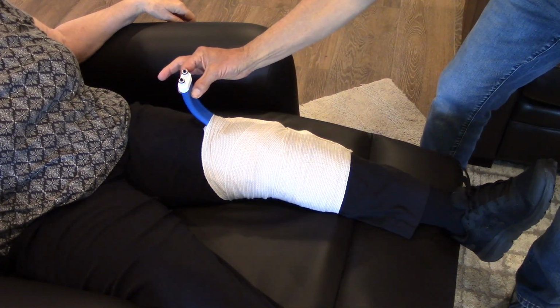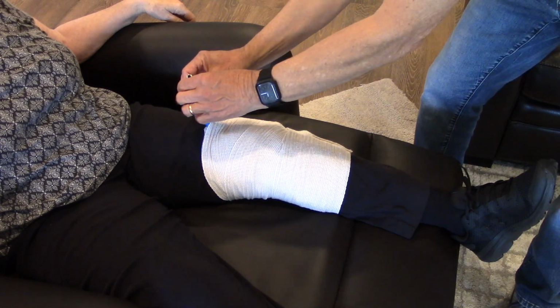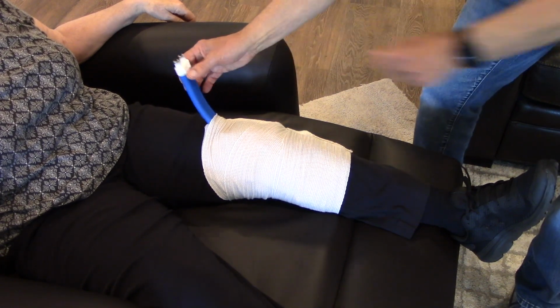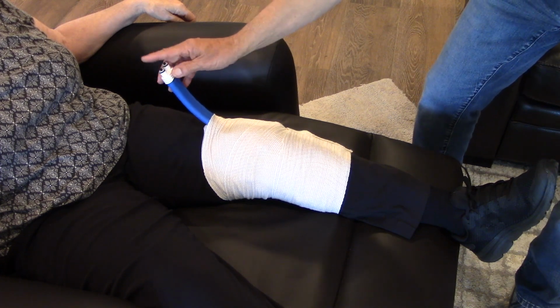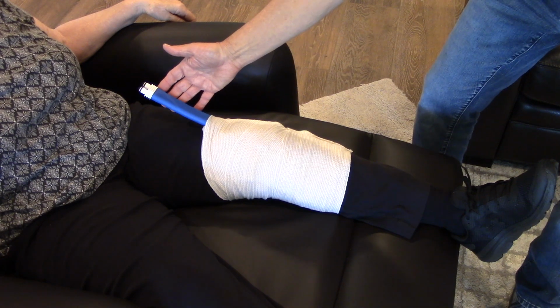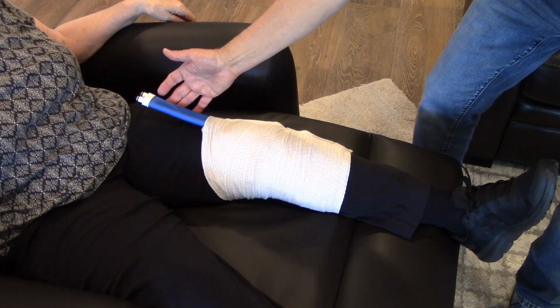And then you can plug the hose into here. These are O-rings that will not leak. They leak a little bit when you pull it apart. That's just the drainage in the joint. And that's all there is to it. Set it on setting 1 or 2 and you're good to go.